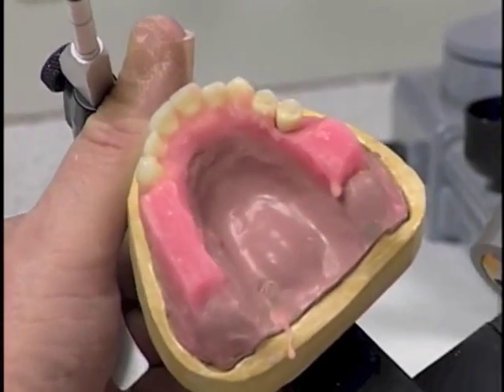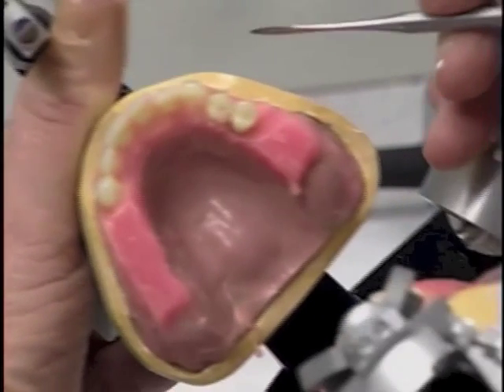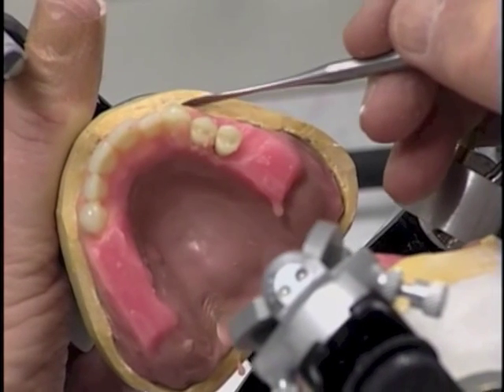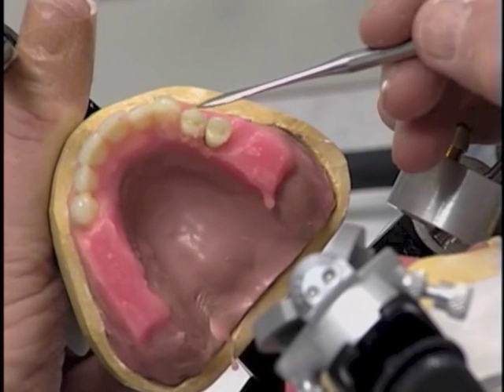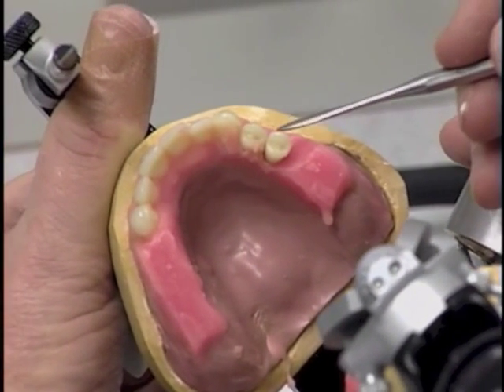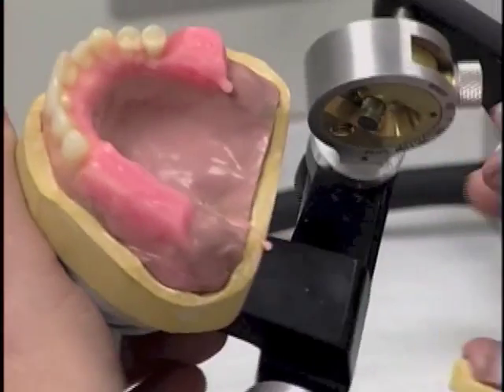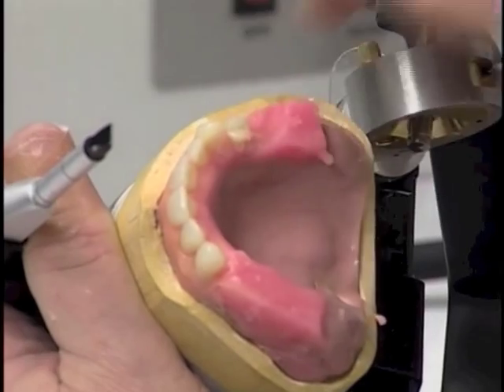The arch form is beginning to look a little weird because basically this tooth is sitting out just slightly too far. It's out just a little farther than this first premolar. So we want to move that tooth lingually just a little bit. So again, we'll have to remove the tooth.